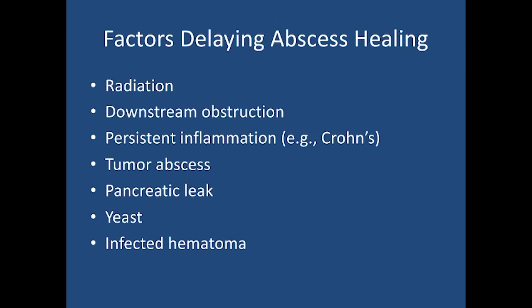When you recognize that one or more of these factors are present, it's again important to manage the patient's expectations and give them a heads up that this may be a drainage catheter that'll stay in longer than usual.